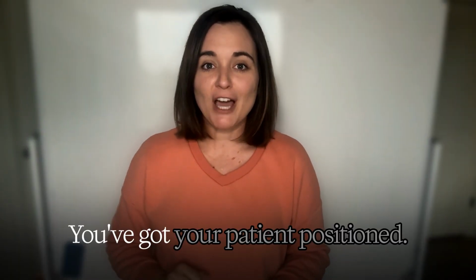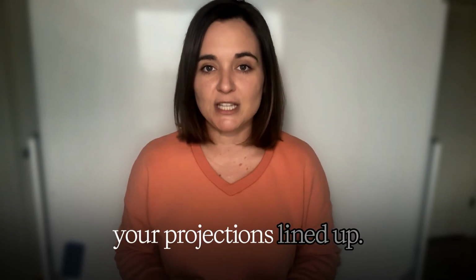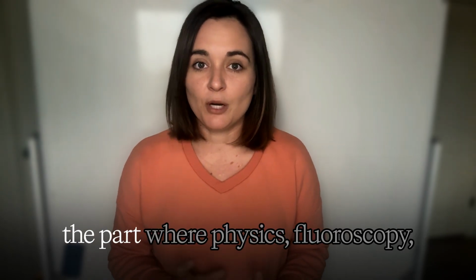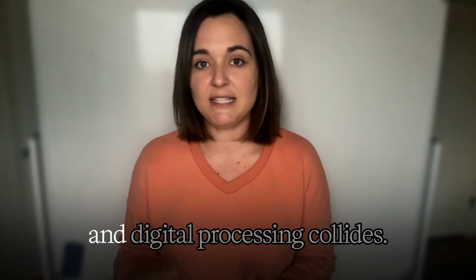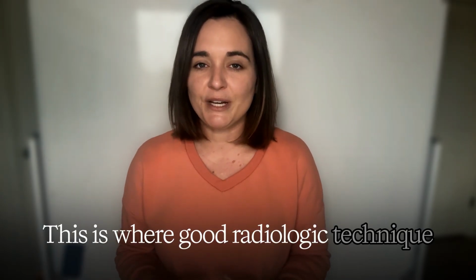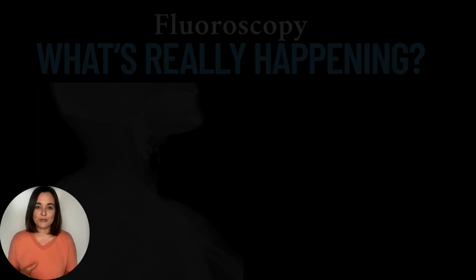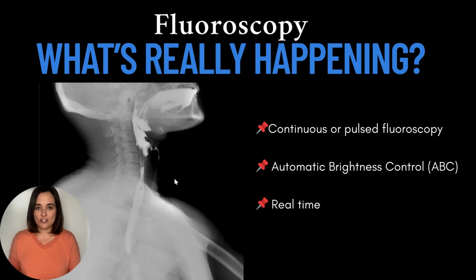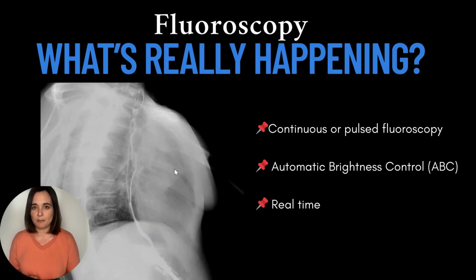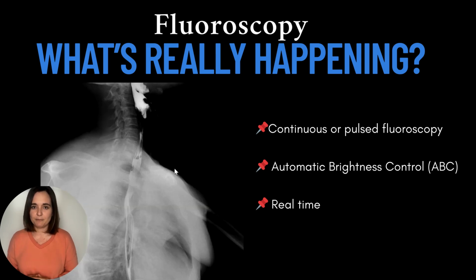Okay, you've got your patient positioned, your contrast is flowing, and your projections lined up. Now it's time to actually create the image, the part where physics, fluoroscopy, and digital processing collide. This is where good radiologic technique becomes great imaging. In fluoroscopy, what's really happening? GI contrast procedures use continuous or pulsed fluoroscopy to capture motion. Think of it like a live video for anatomy.